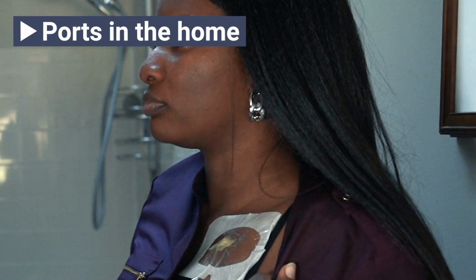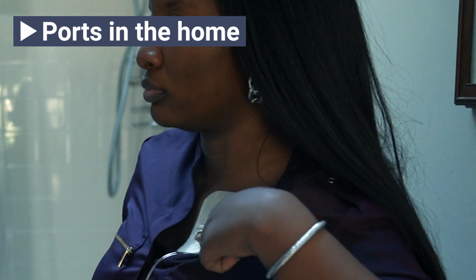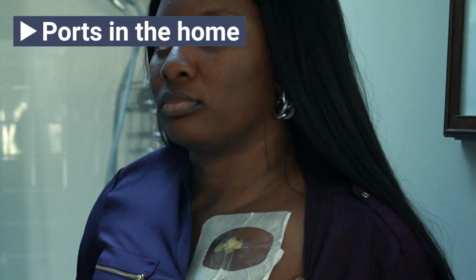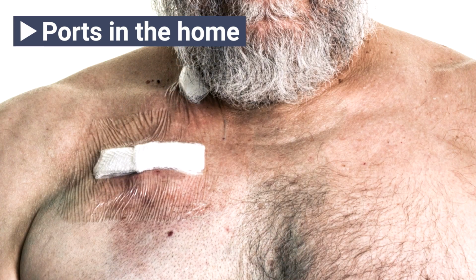Some patients may have a Mediport or port in the home. Ports are placed in your upper chest right under your collarbone. The port is about the diameter of a quarter and thickness of a soda bottle cap and is placed in a pocket under the skin to keep it in place. Once it heals, you may not be able to see the port itself, but you can usually feel its outline in your skin. Inside your skin, the port is connected to one of the major veins in your chest.